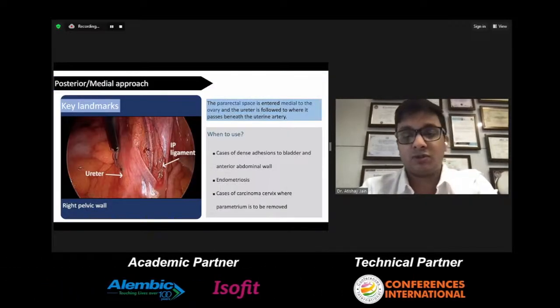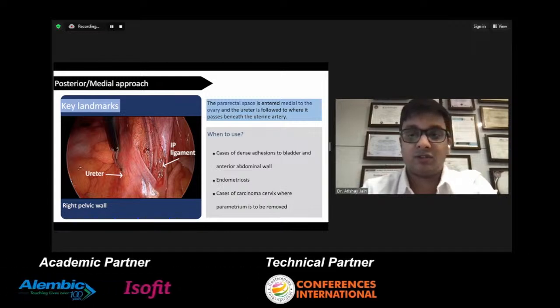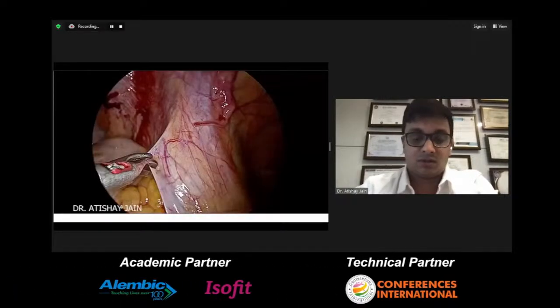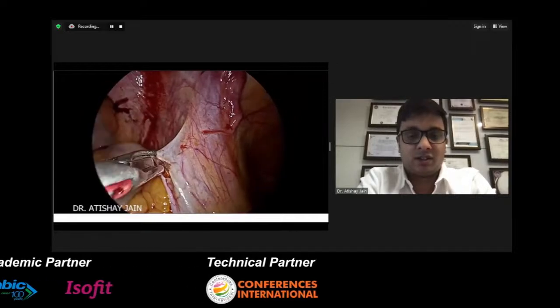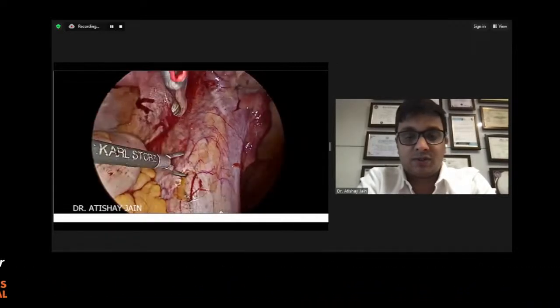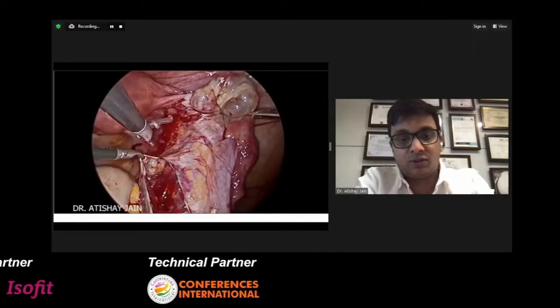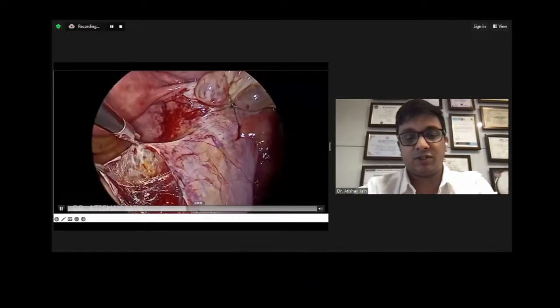Now, the posterior or the medial approach, this approach is used quite a lot when you are performing cases of endometriosis. And in this approach, we enter the retroperitoneum medial to the ovary and the IP ligament. So, this is a case without endometriosis. Here you can see the shadow of the ureter, and we start from the pelvic brim and start going downwards towards the uterosacrals. And when you keep going down, you should always keep the ureter under vision.